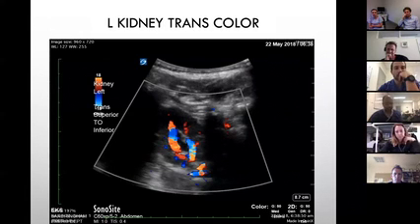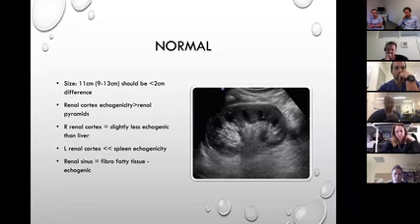All right, then you moved on to your bladder after that. A few normals. Size of the kidney, 9 to 13 centimeters length. I like 9/11. It's much easier for my brain to remember 9/11. So I just go with 9/11.